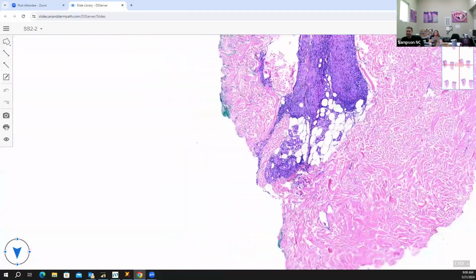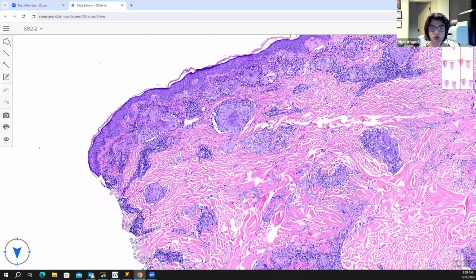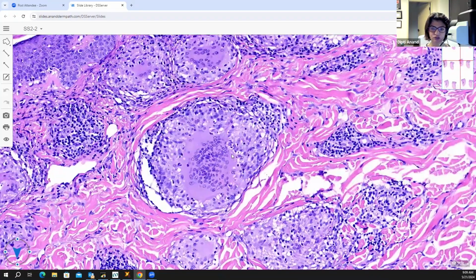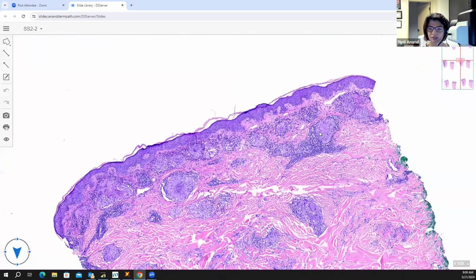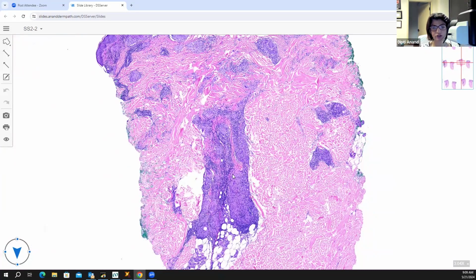Yep, this is sarcoidosis. These are very beautiful. Even though there is a lymphocytic infiltrate, these are not tuberculoid, these are sarcoidal. You can see beautiful multinucleate giant cells, very classic for cutaneous sarcoidosis. These are very pink nodular aggregates forming little fluffy clouds or fist bumps, pretty good for cutaneous sarcoidosis. The lichenoid perivascular pattern is very consistent with primary cutaneous sarcoidosis, instead of back-to-back sarcoidal granulomas, which you would think of as a foreign body.